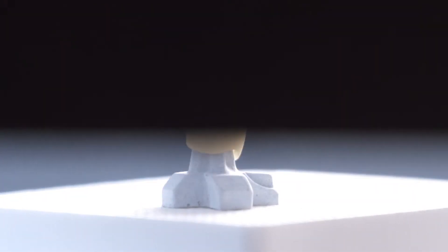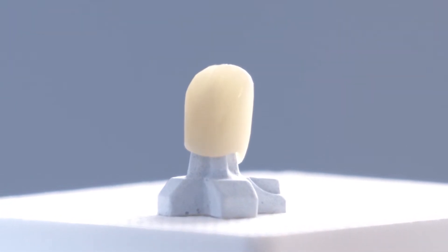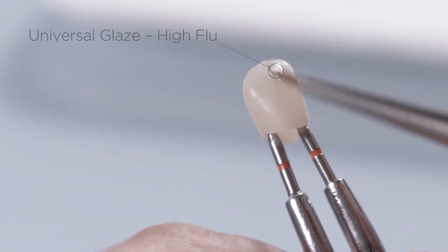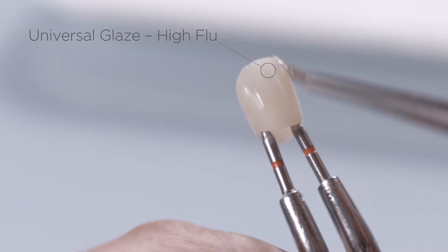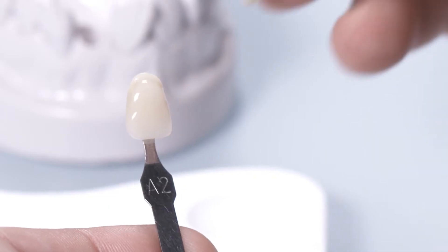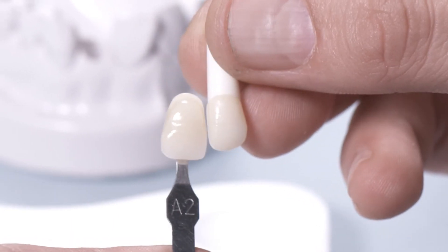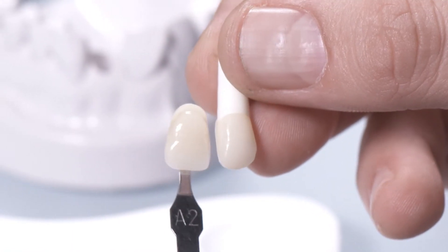After stain firing, add High Flu Universal Overglaze to the monolithic restoration. The final shade check against the shade tab confirms the quick and easy shade reproduction with appealing aesthetics.